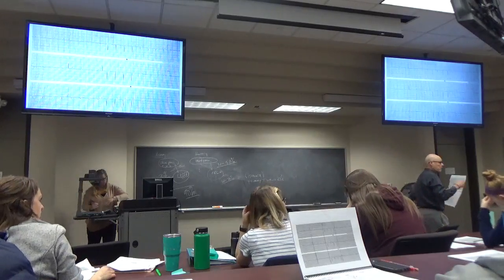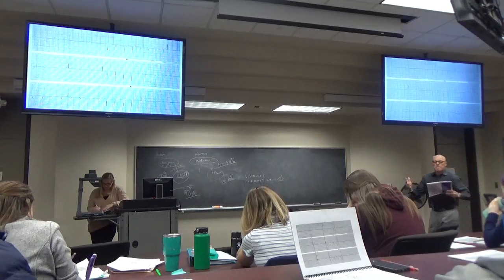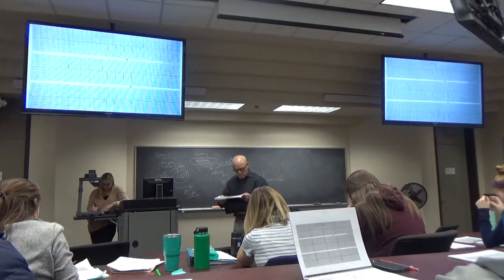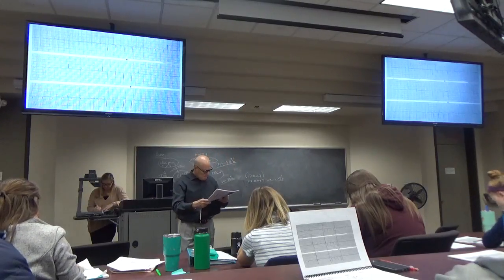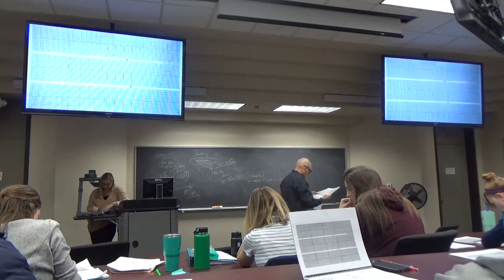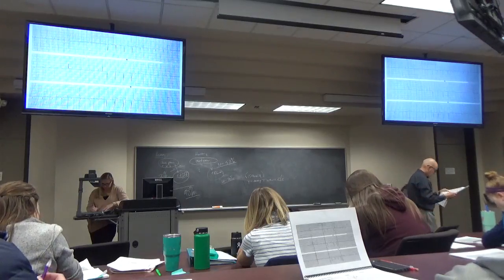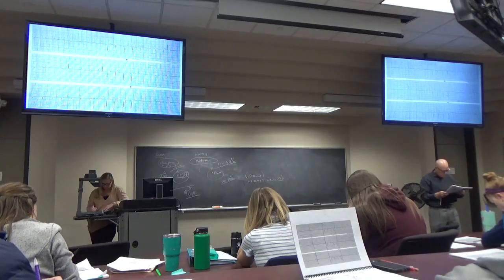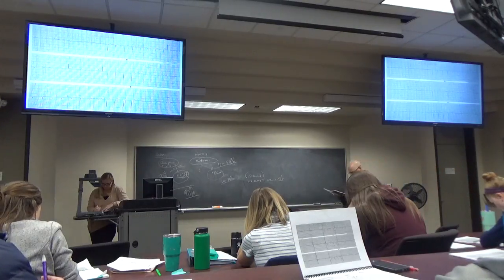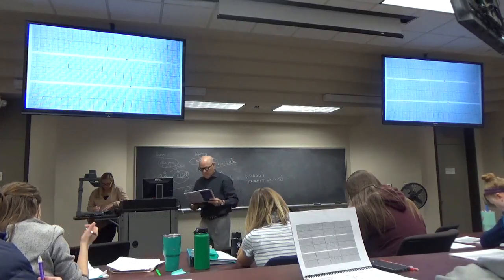Regular is kind of nice, but it's what? Sinus. A regular sinus rhythm, okay. Heart rate 95, PR 0.24 seconds, QRS 0.04 varying to 0.08, QT 0.32, mean QRS axis LAD minus 65 degrees, found Q waves in 2, 3, and aVF, so one family, inferior. V1, V2, septal family, V3, V4, anterior family.